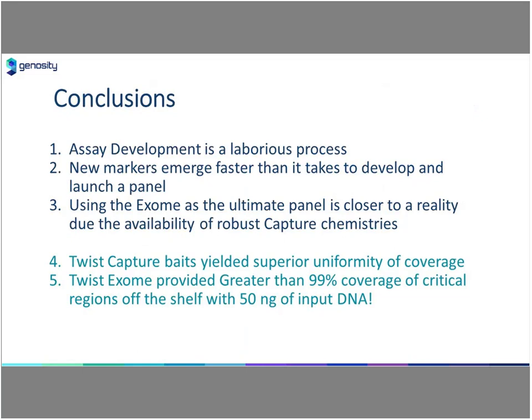So before I hand this over, just several conclusions. One, for anyone who's been involved in assay development, it's a known, very laborious process. It takes a lot of time. And oftentimes new markers are emerging at the tail end of a development project and make it challenging to stay ahead of. Using the exome as an ultimate panel is really closer to a reality due to things like these robust chemistries as well as decreasing sequencing costs.